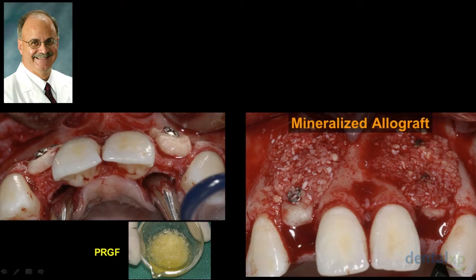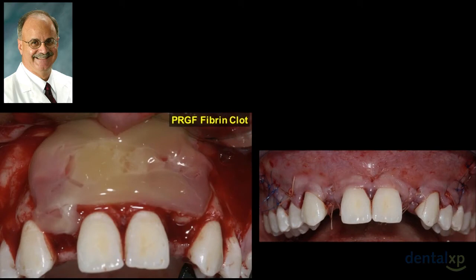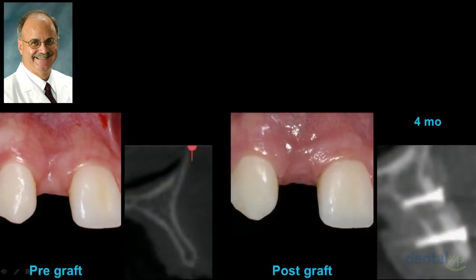Prior to that, 10, 11 years was PRP. These, again, modifiers allow you to handle the graft particulate more easily. We'll place a membrane over everything, and even using a fibrin clot from this particular technology, which really enhances and upregulates growth factors beautifully.